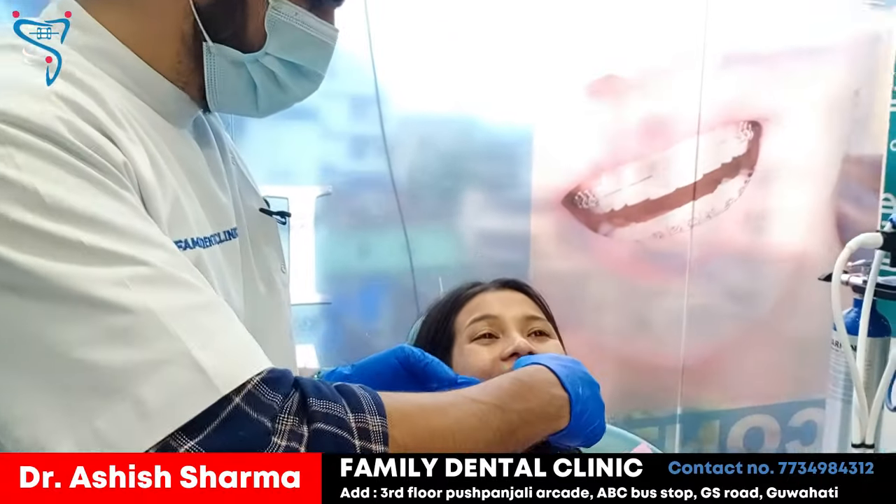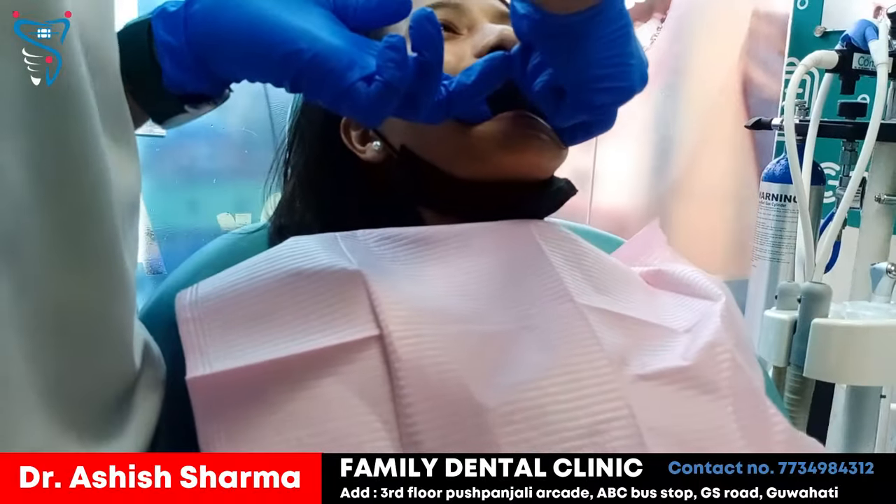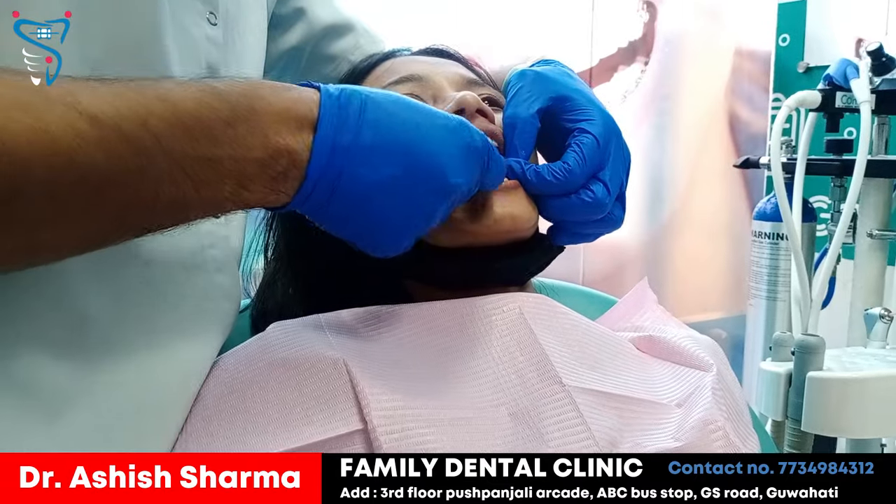For the lower retainer, use your two fingers. On the back side, push it from here a bit, and from this side a bit. That's it.